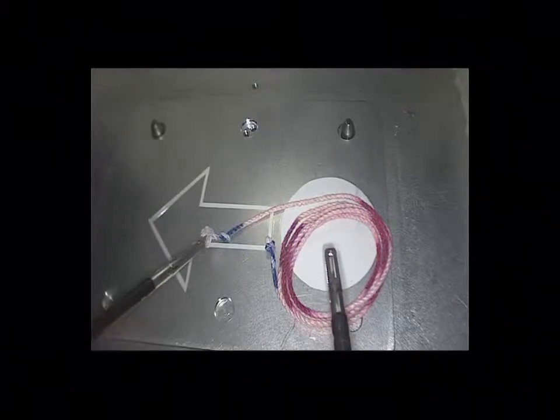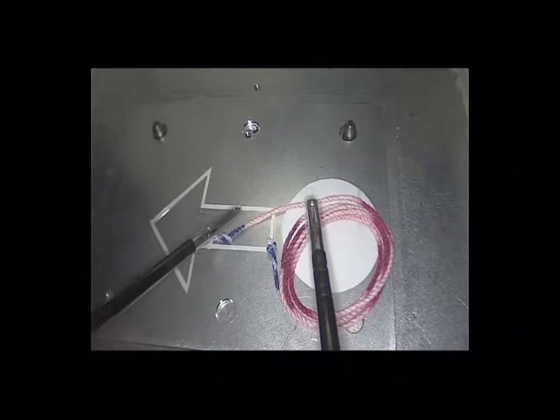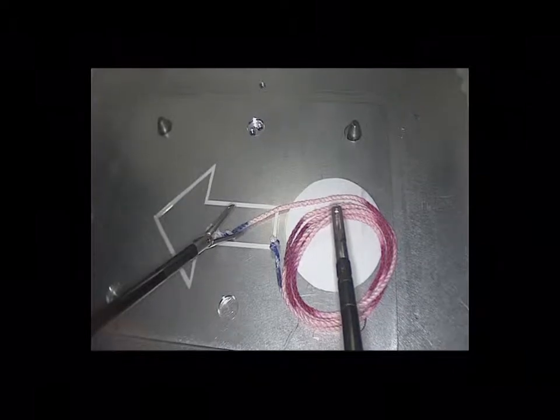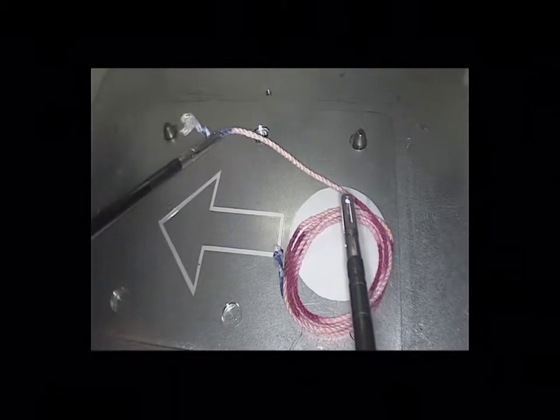Now let's go over how you should execute the cobra rope drill. This is a two-handed drill and it also stresses your non-dominant hand. When your operator or instructor says 'ready, set, go,' you should go and pick this up like so.